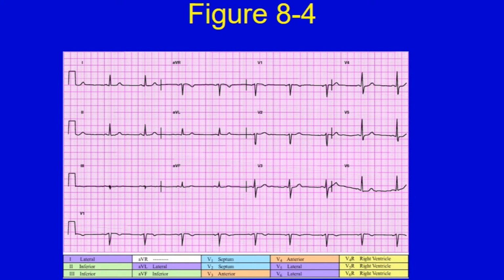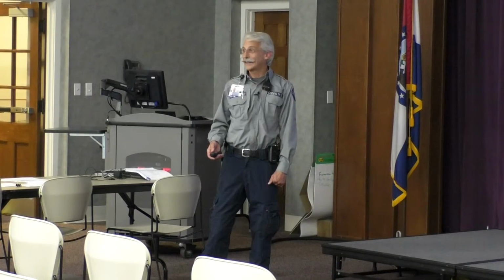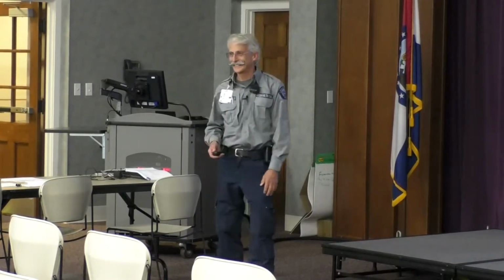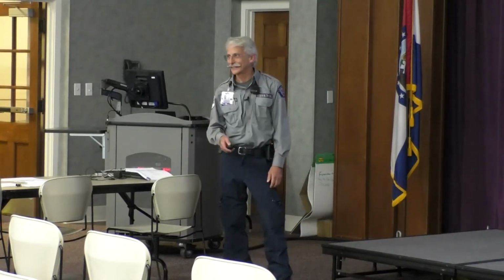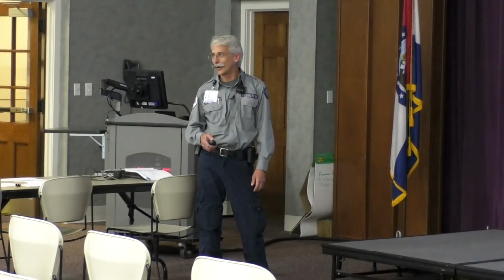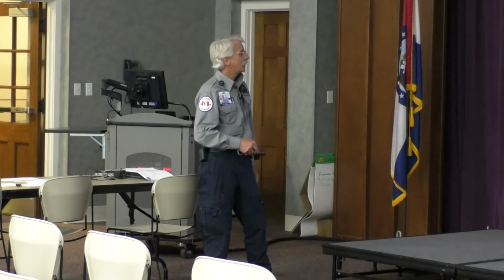I don't care if you do V1 or 2 or exactly what you do. Do you know you can do that with our monitors? No. You can, okay? We're not doing that today. The LifePak 15 will do that. Yeah, I will show you. That's a one-on-one thing, yes. There's a lot of fun things our packs will do that we just don't remember. We've been maybe shown once. Well, why would I remember that? So, all right.